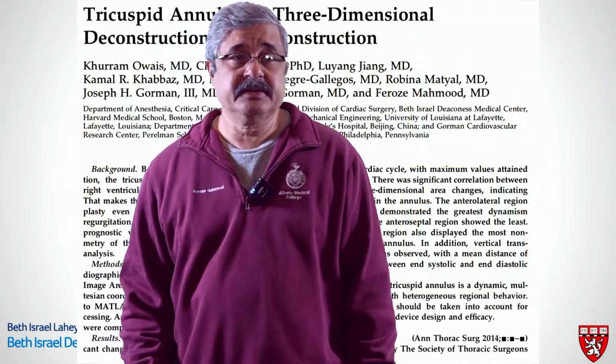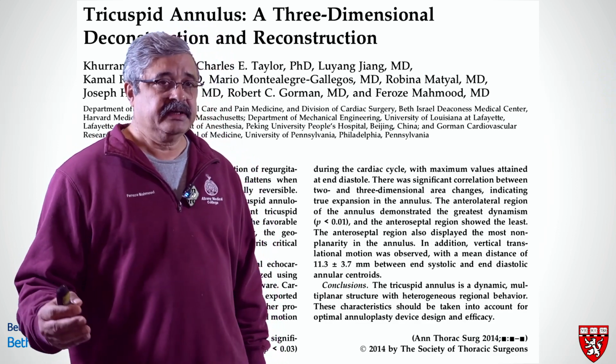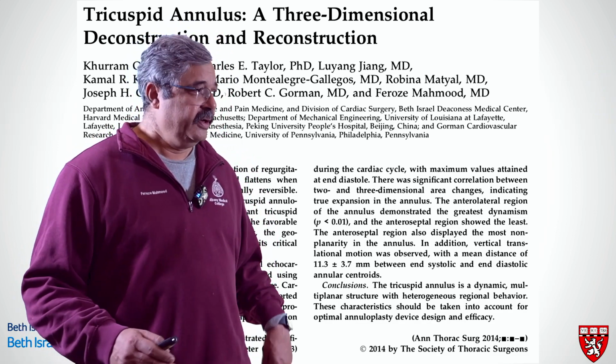So this is another one of our papers that we are actually very proud of, in which we took three-dimensional data sets of the tricuspid valve.